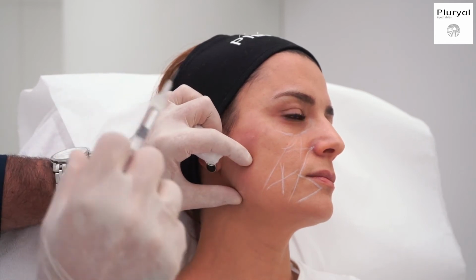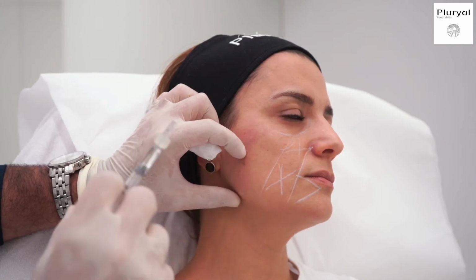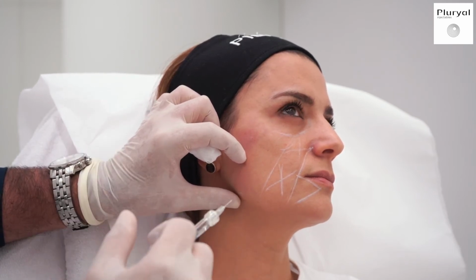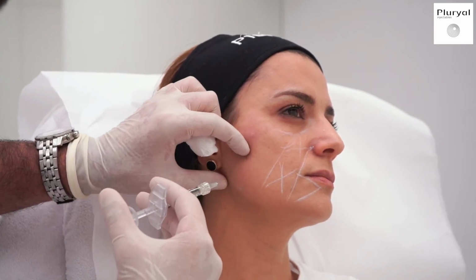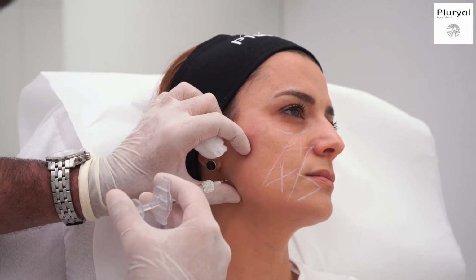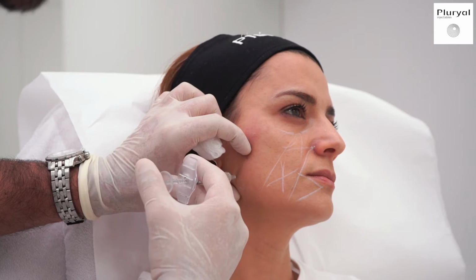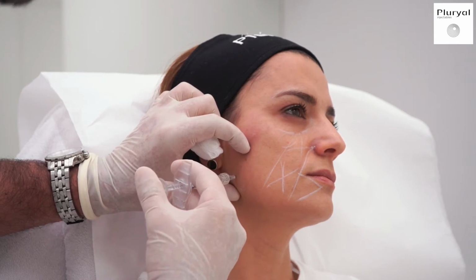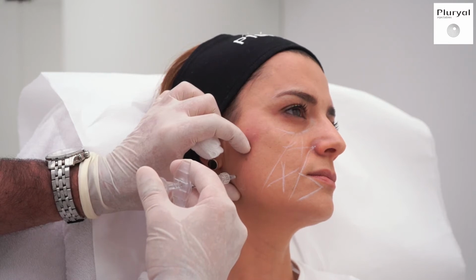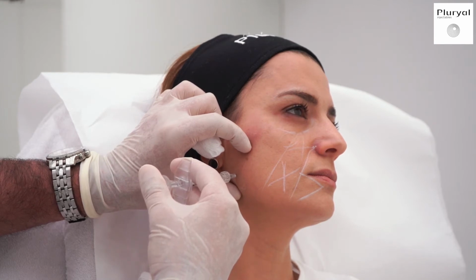Also, whenever I will be using Pluryal contour lidocaine, whenever I do a bolus, I go very deep to the bone. So I touch the angle and I go straight to the bone. I will be putting 0.25. I don't have to do the aspiration here because there are no veins or arteries.